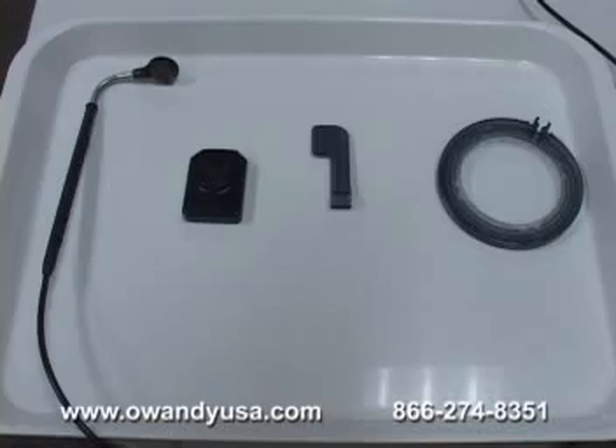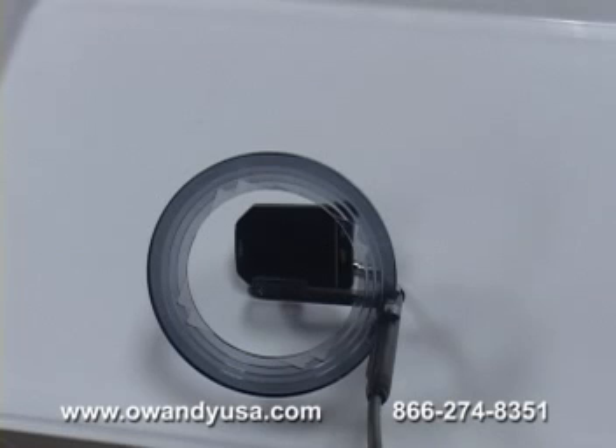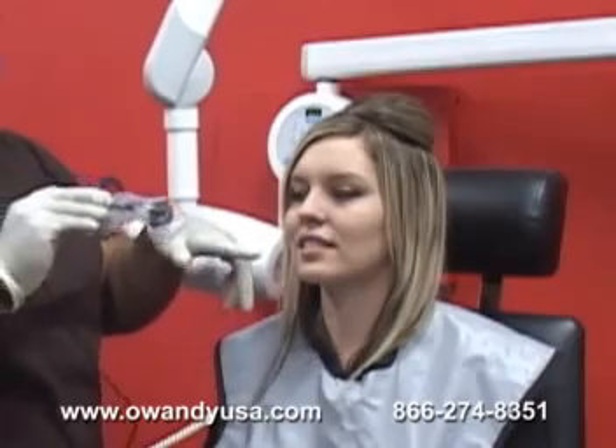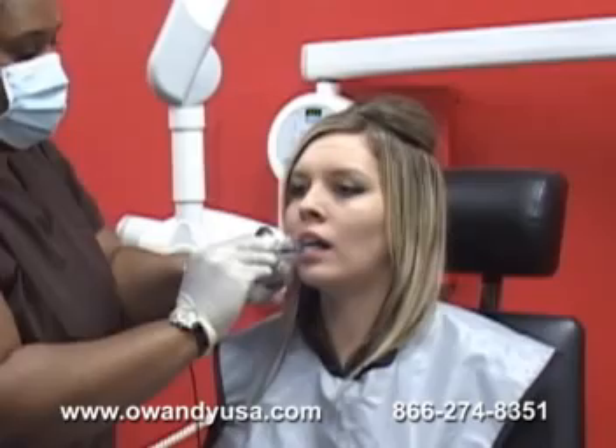Using a sensor that does not require a ring kit or a snap array has many great benefits, the number one being that ring kits are sometimes flimsy and do not accommodate every patient. With the Visteo, the same sensor can be used for every image. To demonstrate how easy the Visteo sensor is to use, our dental assistant begins here with the lower right position.